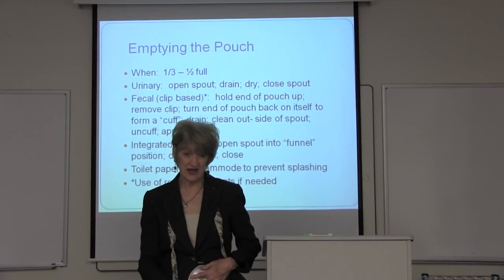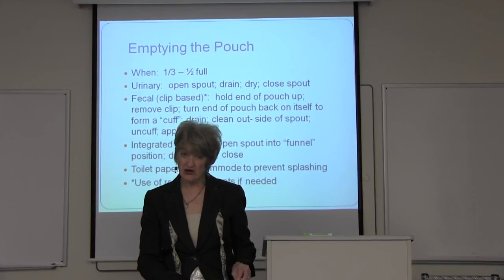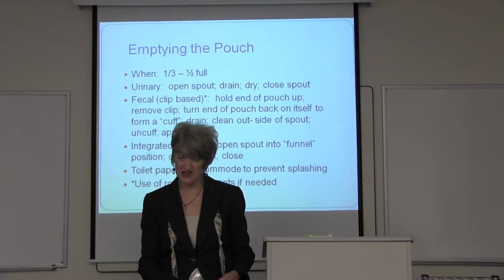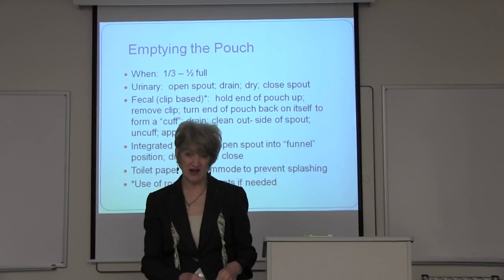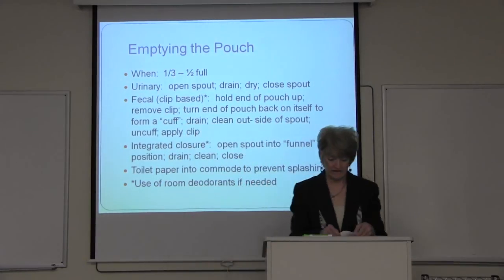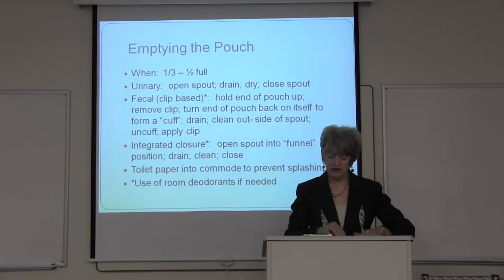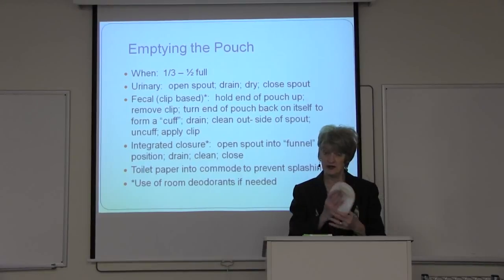That one little technique makes patients feel much cleaner in emptying their pouches and significantly improves their protection against odor, because this end stays completely clean all the time.